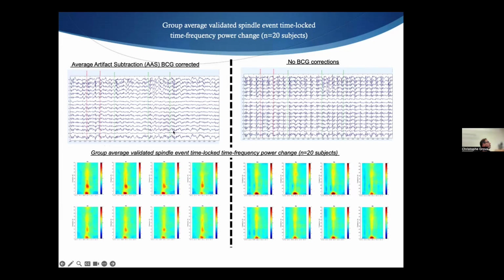And of course, if you compare BCG corrections and no BCG corrections, when you have no BCG correction, all the power goes there and you get almost nothing in your band. So you see that. And of course, you also have transients. This is why you have these bands that go to some high frequency over there. So that's a little bit where we are.